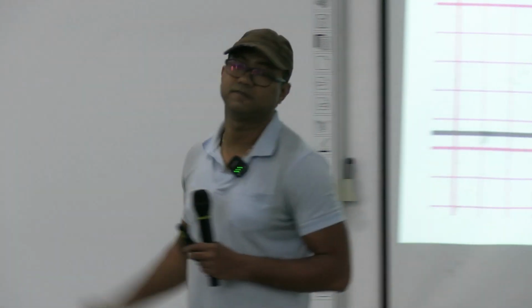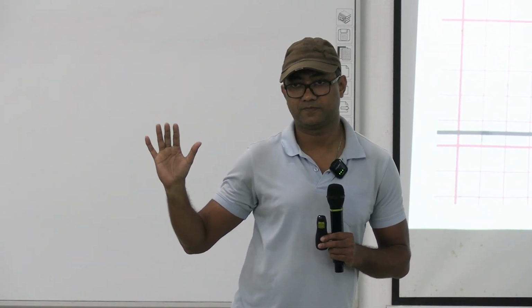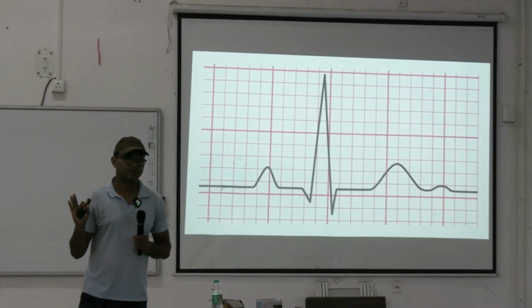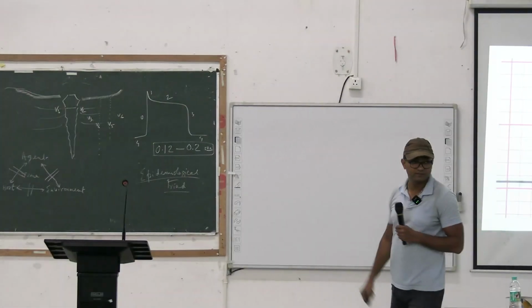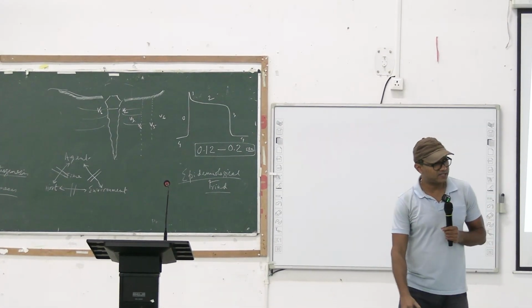So, that means, simply, from 3 small squares to 5 small squares, right. So, in PR interval there must be 3 to 5 small squares. Okay. If less than 3 small squares means 0.12 second, clear, 0.04 into 3, okay, and 0.2 second means 5 small squares. Okay.